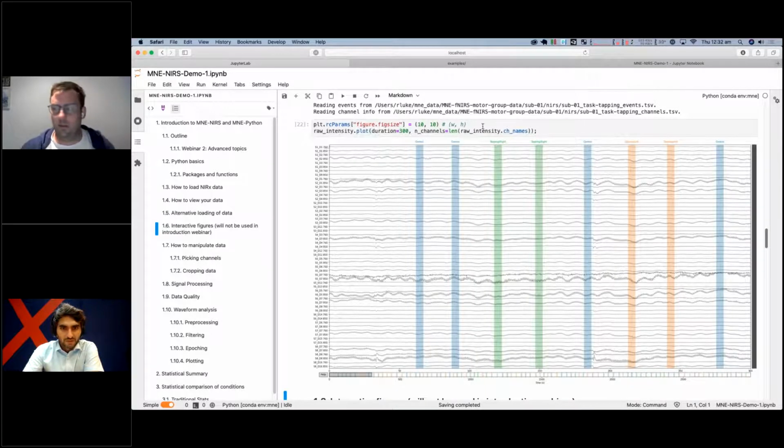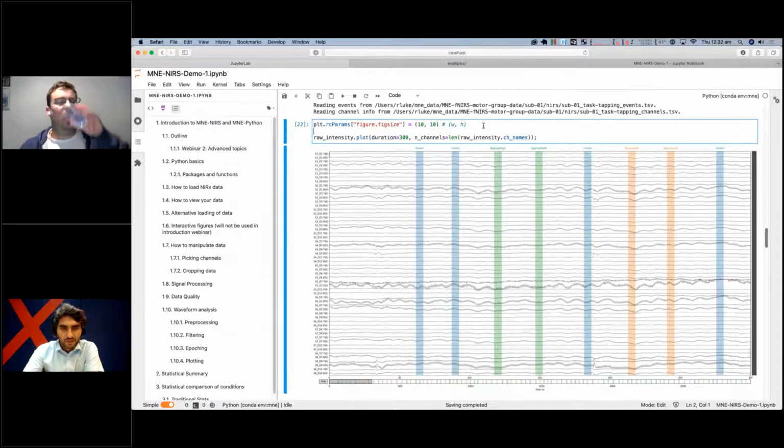One more question, Rob. I'm sorry to interrupt again. It seems relevant, just came in. A source of layout files for different optode layouts would be very useful. Do we have to create it by hand if we use a specific layout?